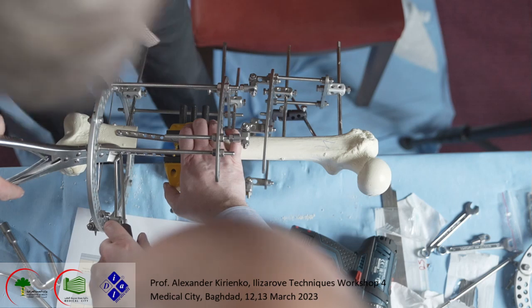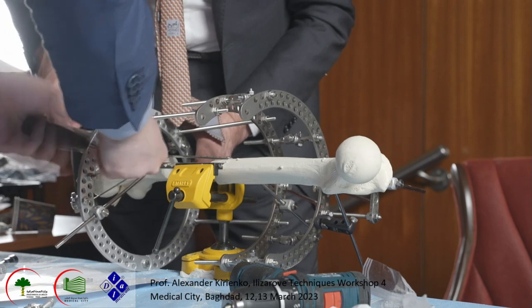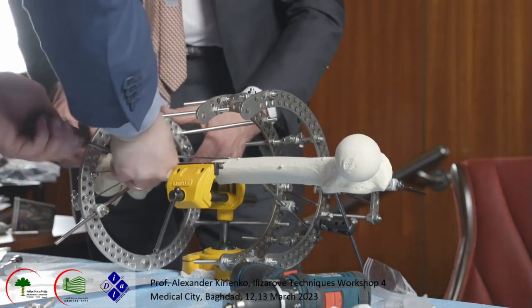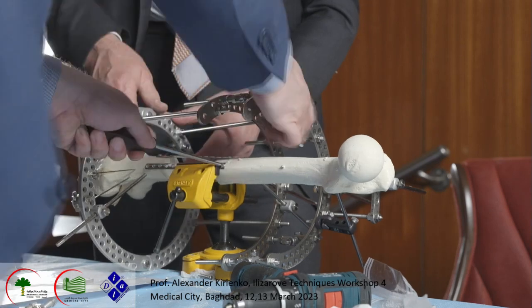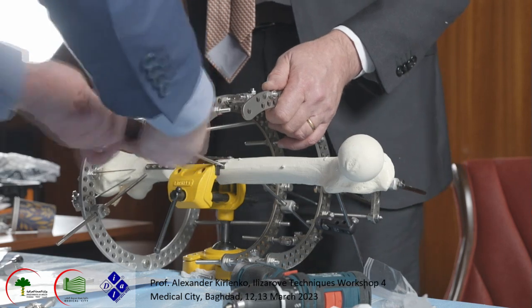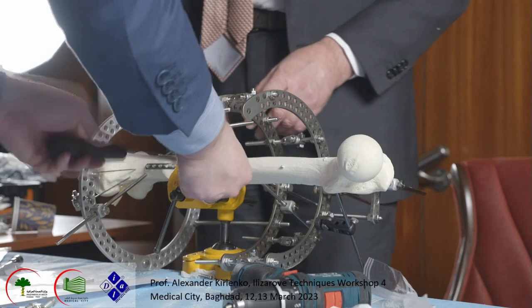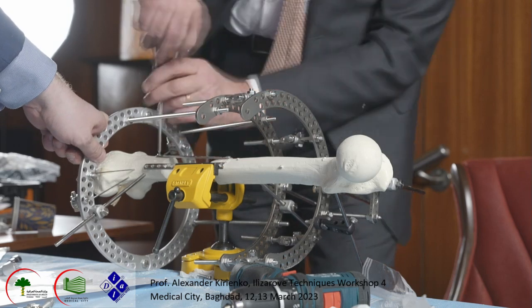Probably we should tension something. So under, okay. Bene. Remove this. Okay. And now we remove another 2 screws in this way, and the defect we have.